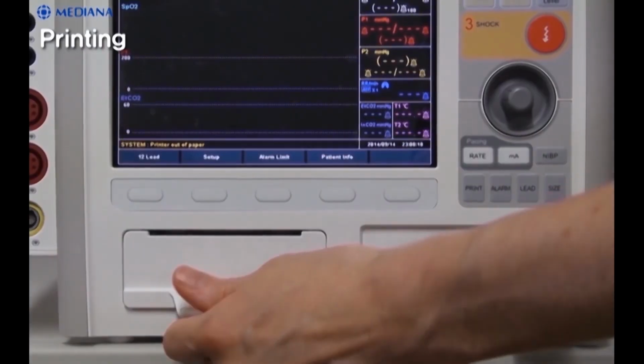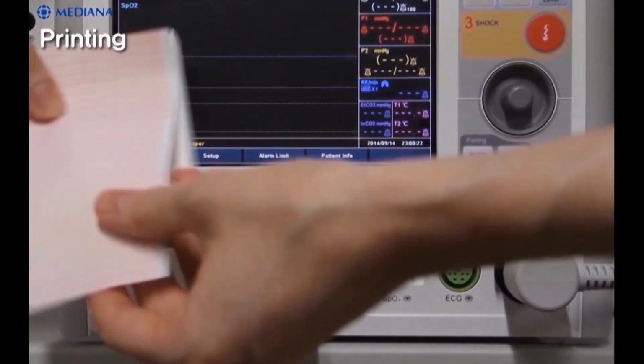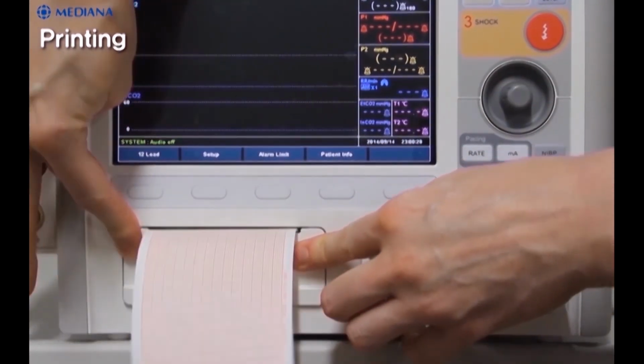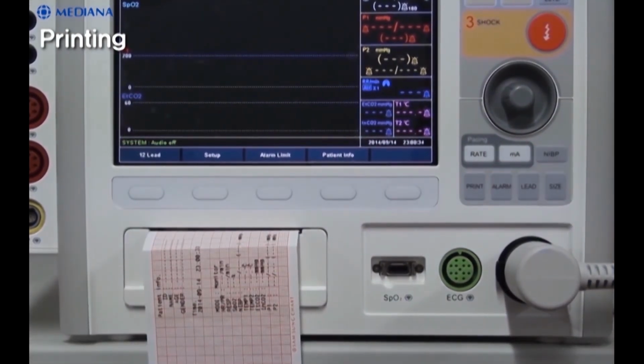Let's see how to print data. Before printing, please verify that printer paper is loaded, and if necessary, load the printer paper. After pulling the printer door open, you can take out the paper by using the ejector. Insert new printer paper with the grid side up and push the printer door. Then press the print button.